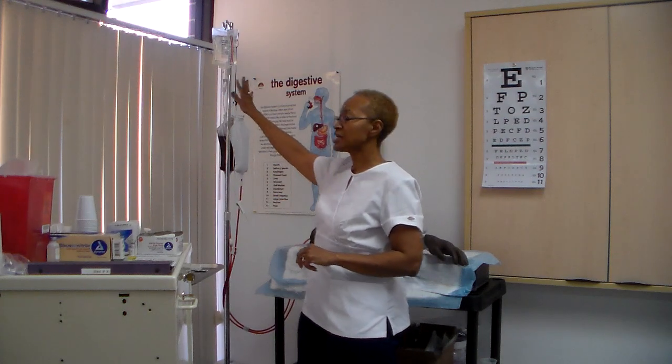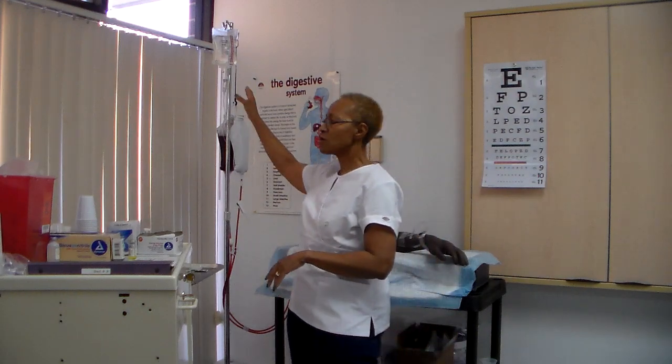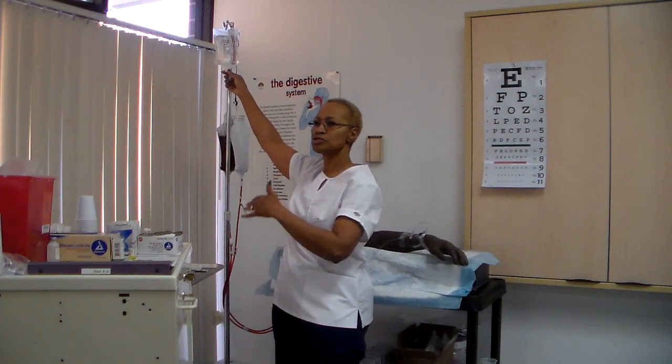Now. Add medication to existing container. Okay, so before she reads that, sometimes the doctor may order just that potassium be added to the present bag. What we did is we added to a different bag. So the doctor may order for it to be added to the present bag. So you will be coming in with your syringe, you'll clean your port, and you're going to add it to the present bag. That's what you're going to read now.